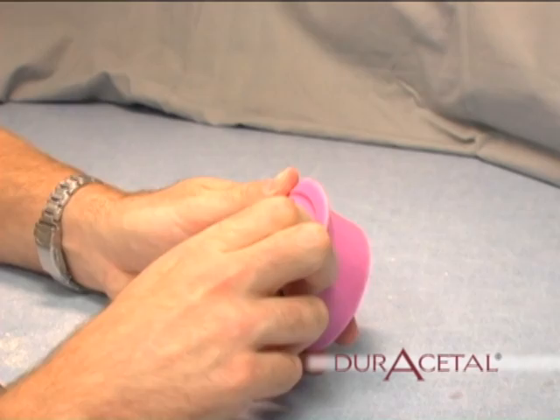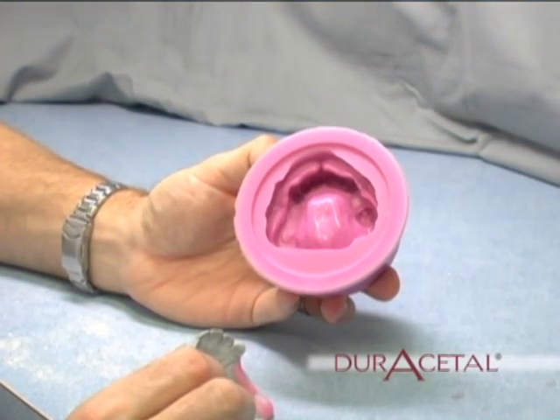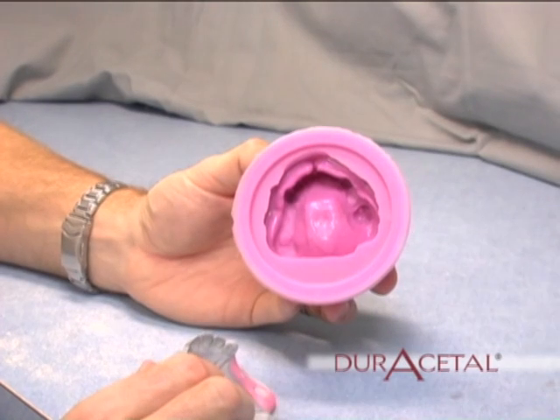Duplicate the model. After blocking out the model, it is time to duplicate. Use reversible or permanent duplicating materials to make your mold.